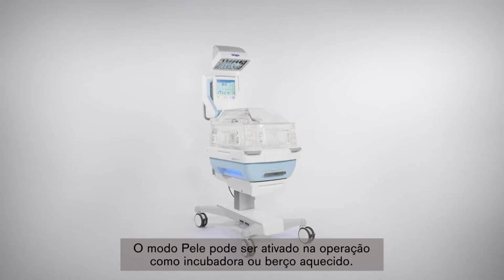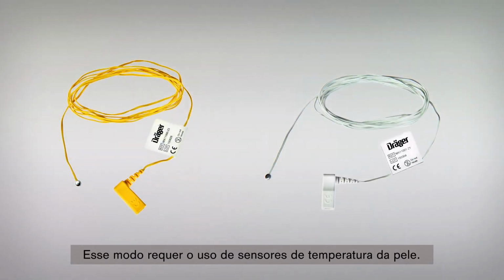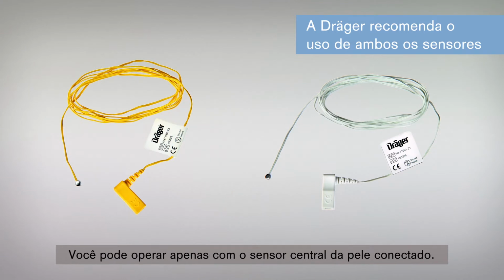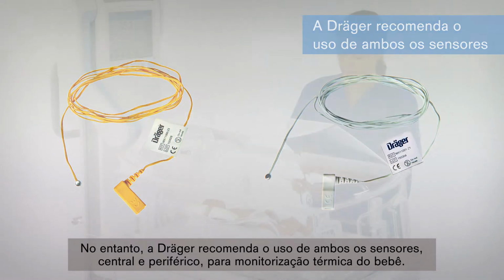Skin temperature mode can be activated in both incubator operation and in radiant warmer operation. The skin mode requires the use of skin temperature sensors. You can operate at minimum with only the central skin sensor connected. However, Dräger recommends using both sensors, the central and the peripheral, for thermo-monitoring of the baby.